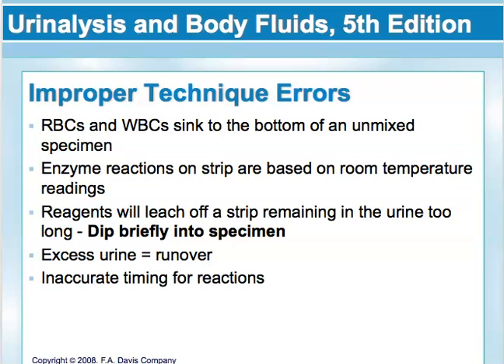You want to be mindful of the time that each test takes for the reaction so that you're ready for the interpretation. So if you're reading results manually, you're keeping your eye on the clock while you're also looking at the reagent, the colors, the results. The amount of time is manufacturer specific, so you also have to be mindful of different guidelines. Reagent strips and color charts from different manufacturers are not interchangeable.